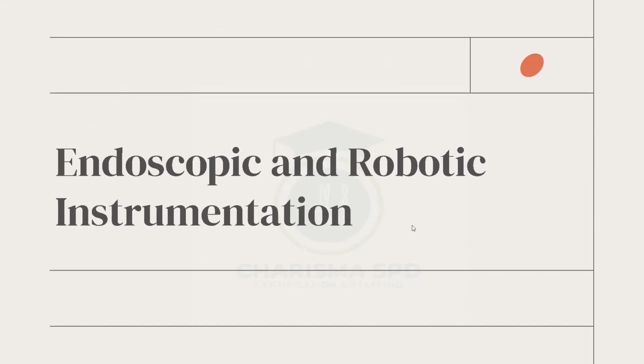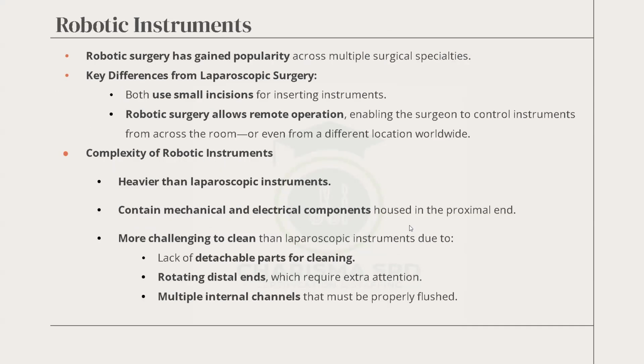Now, let's come to the robotic endoscope. It is an endoscope going inside your body. It's not controlled by the surgeon directly, but by a machine with the press of some buttons. Like how many of you have been playing video games? I don't know how to play, but I've seen my son play a lot.